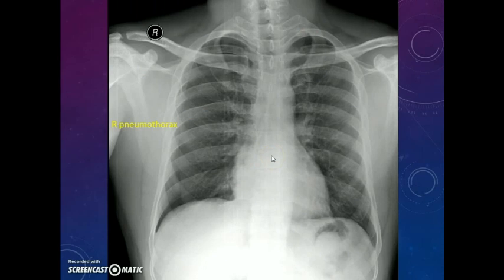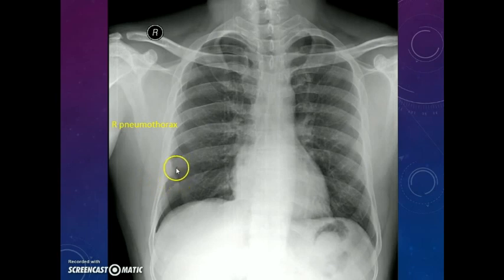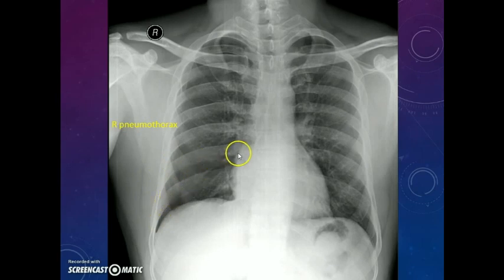This is another case of right pneumothorax. The pneumothorax may not always be very pronounced — it can be subtle. You can see the lung margin here and the absence of parenchymal markings here. But there is not much mediastinal shift because it is a small pneumothorax.